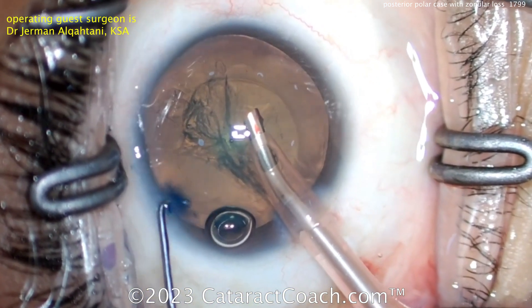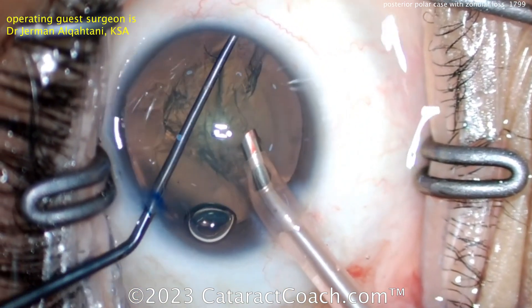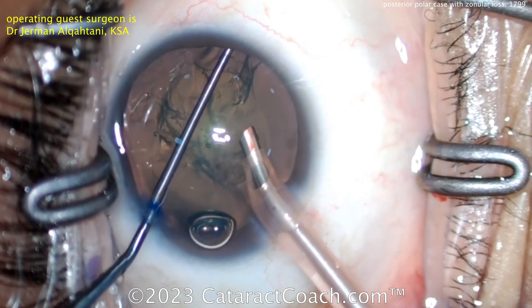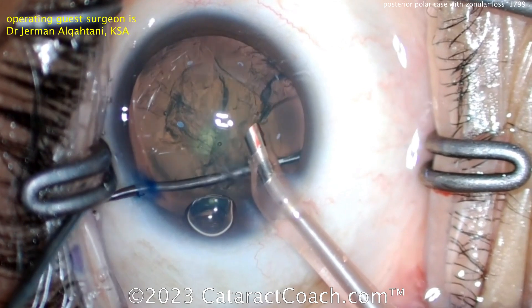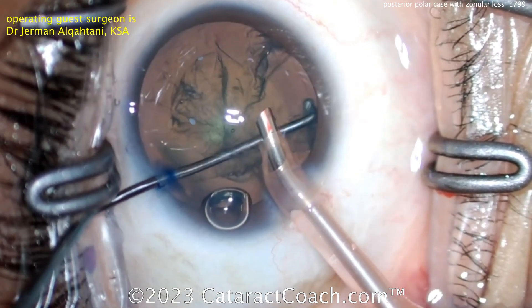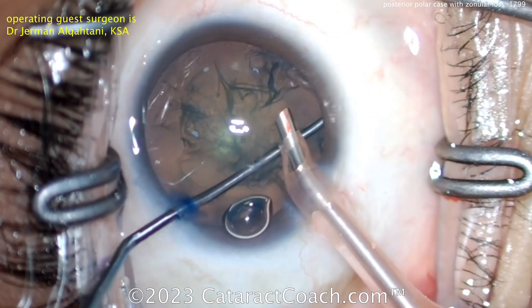Now it looks like the phaco probe is in the eye. The surgeon who submitted the video did the editing, so forgive any choppiness. There's the chopper going around again — I like that the infusion is inside the eye. Got to be very careful here, now doing a mechanical dissection pulling the cataract material away from the capsule.